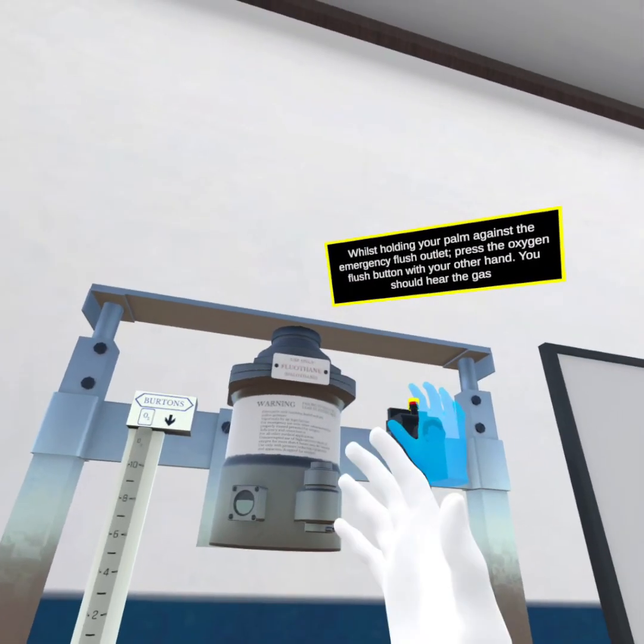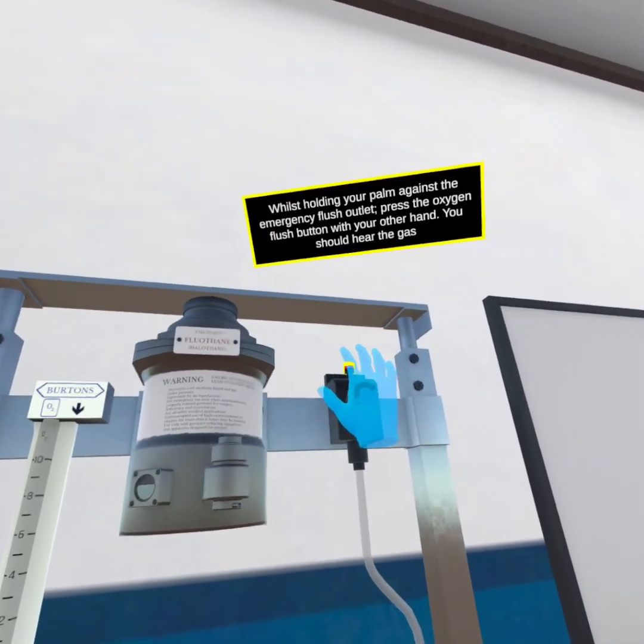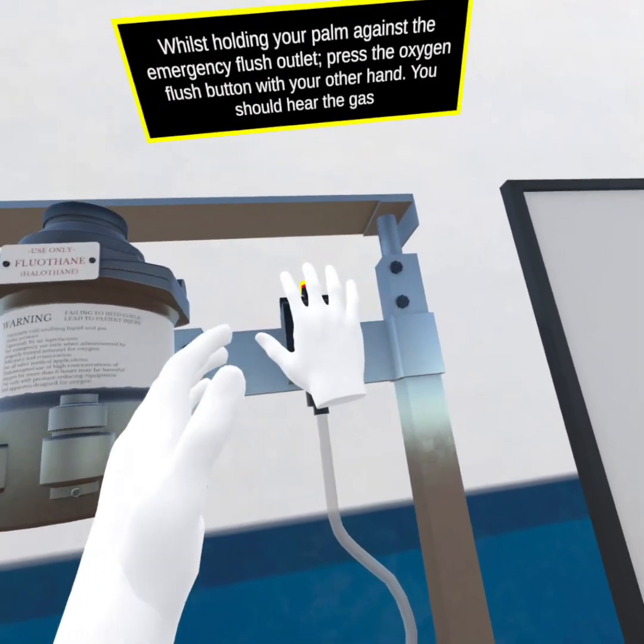Whilst holding your palm against the emergency flush outlet, press the oxygen flush button with your other hand. You should hear the gas.